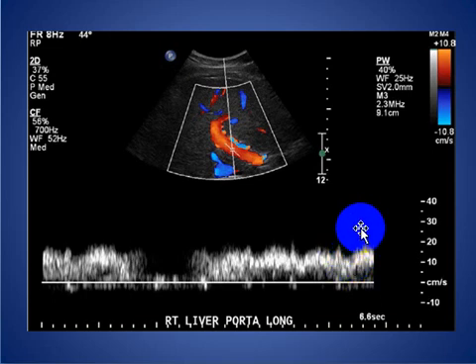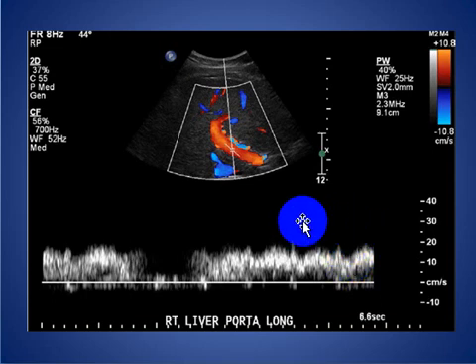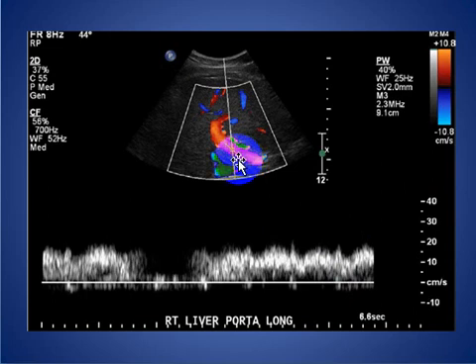Evaluation of the spectral portal vein analysis is important, especially with diffuse liver disease like liver cirrhosis. We want to assess whether the portal vein flow is normal hepatopetal or reversed — hepatofugal flow direction.